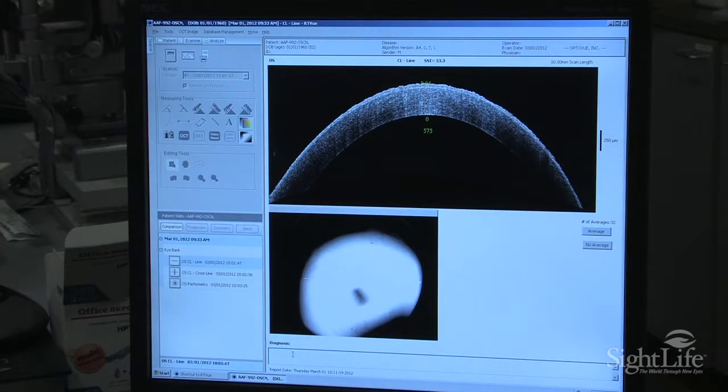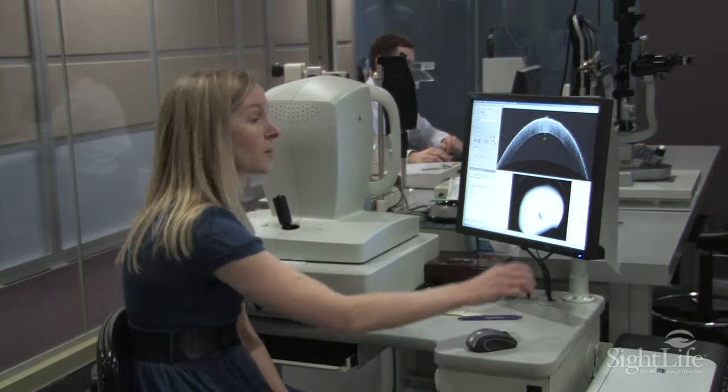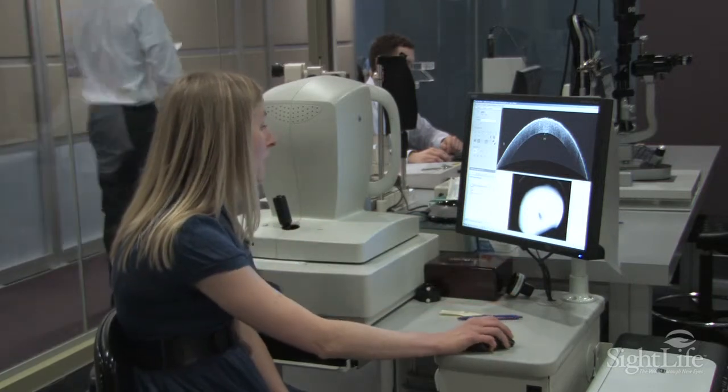This particular cornea right here is 575 microns. This is just a cross-section of the cornea itself.